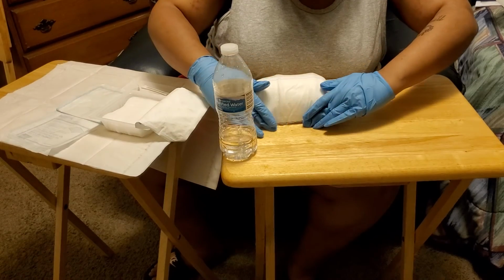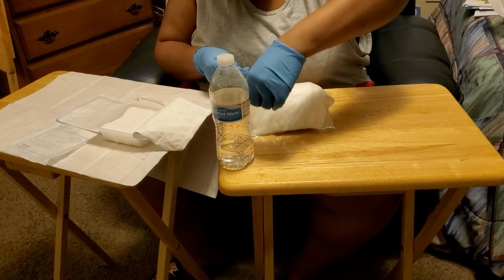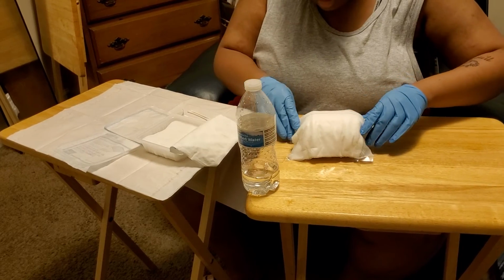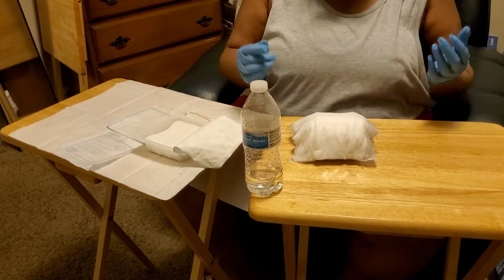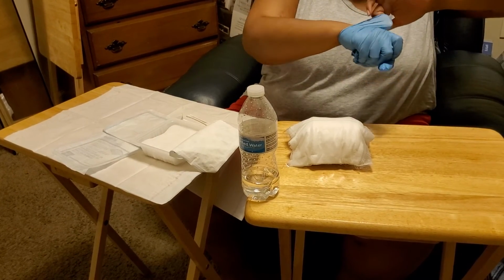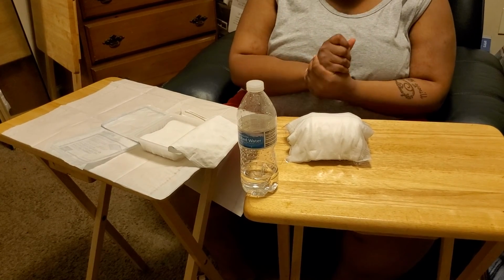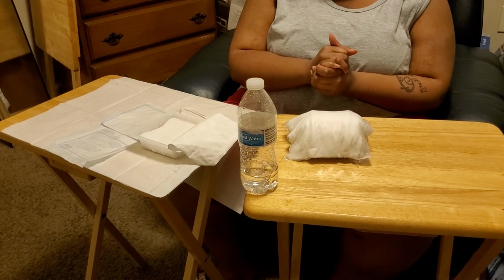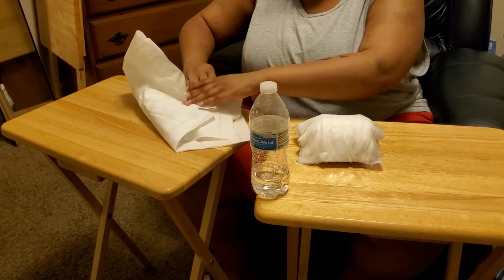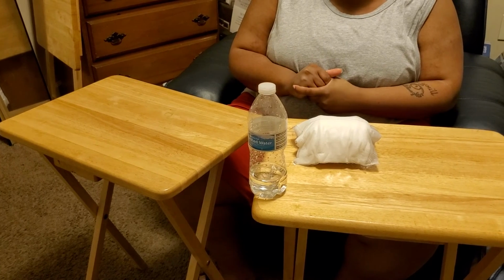Okay, place at the top. It would also be flat onto the skin, and then one on the right, and that would also be flat on skin. Alrighty, then after that, I would remove my gloves, as so. Dispose of them, wash my hands, make sure that the patient doesn't need anything before I leave, and then I would also dispose of all of my materials, as so. And that would be the end of my session.